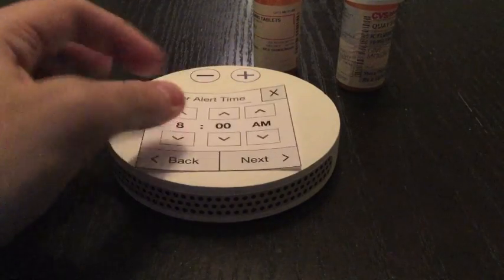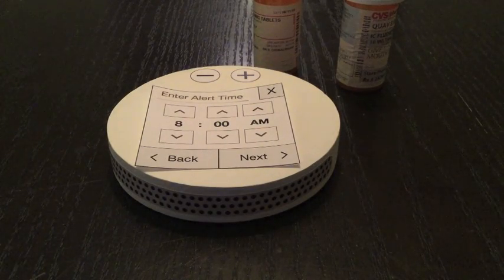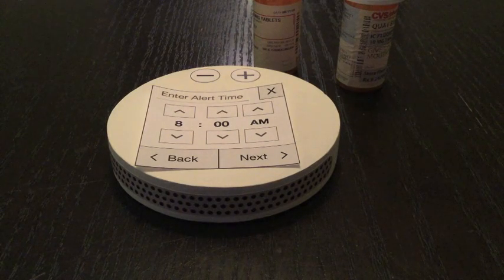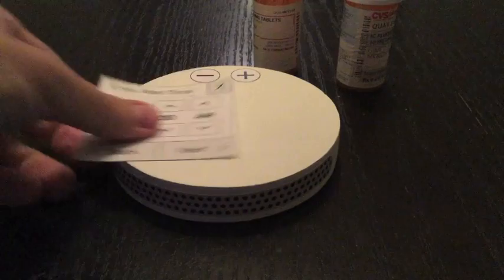From there, they're asked to enter the time. If the frequency of the medication is more than once a day, the device will automatically divide a 24-hour period up. So all the user would need to do is set the first time, and every time after that would automatically be set by the device. Once correct, user clicks Next.